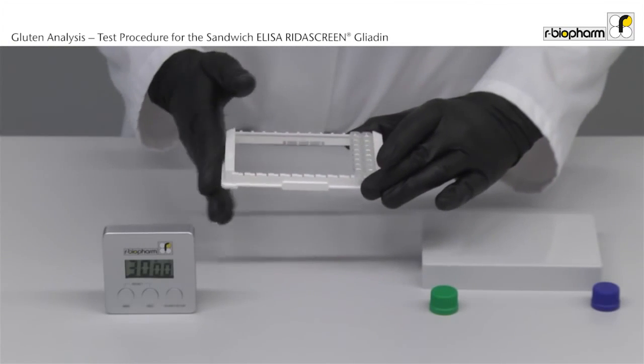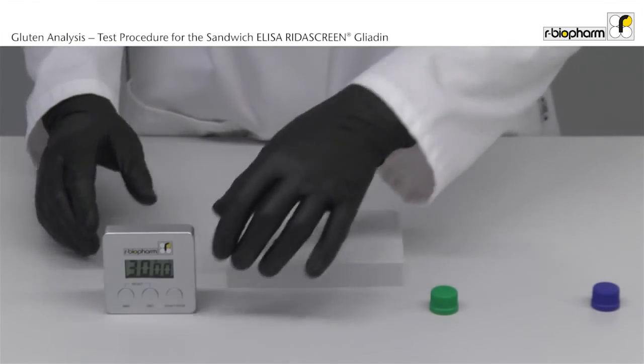Carefully rock the plate to mix substrate and conjugate. Incubate 30 minutes in the dark at room temperature.